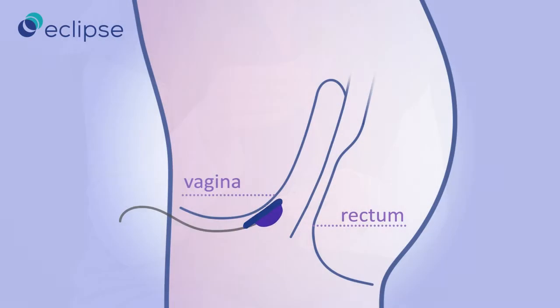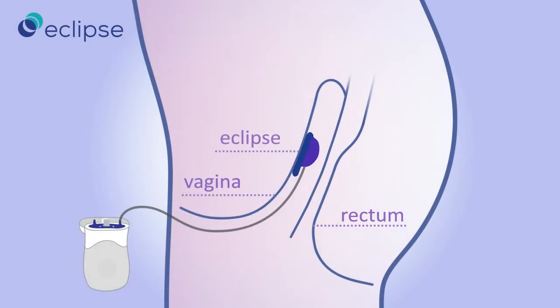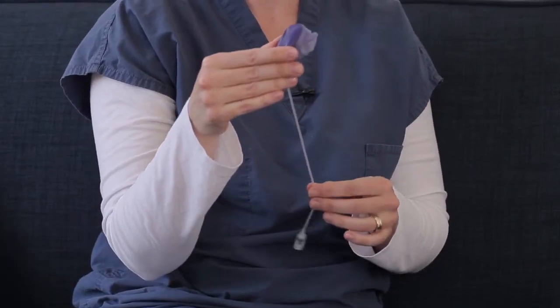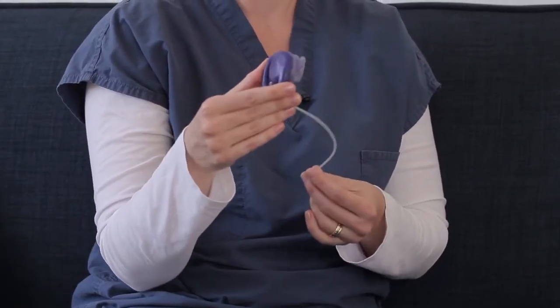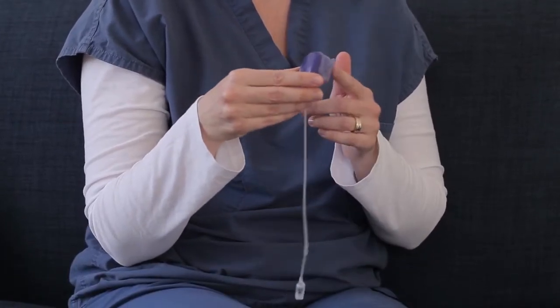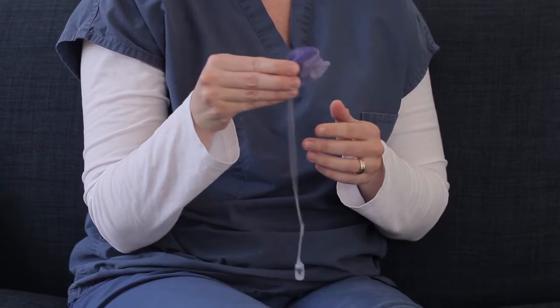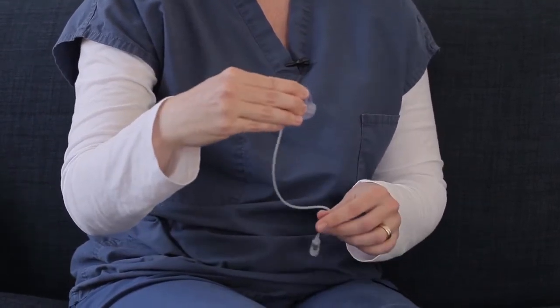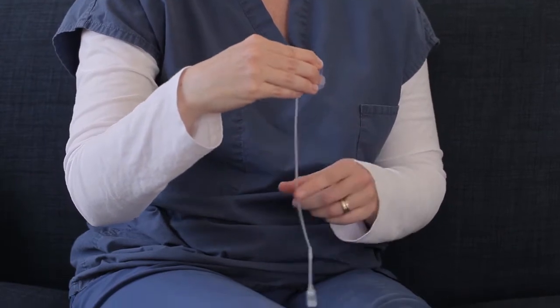It fits inside your vagina in the same location that a tampon would or a diaphragm. Once it's inside the vagina, the string comes out through the vaginal opening, similar to a tampon string. To insert the device, you make sure the balloon is in the deflated position. You flex the base and insert it into the vagina with the balloon down and facing towards your back.